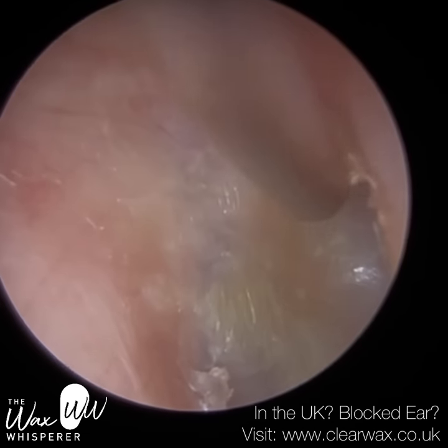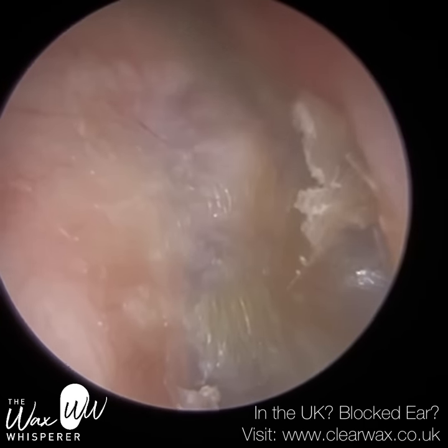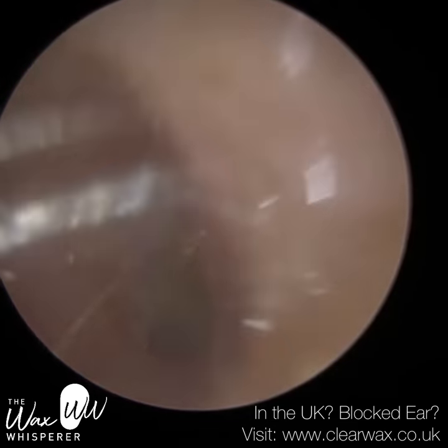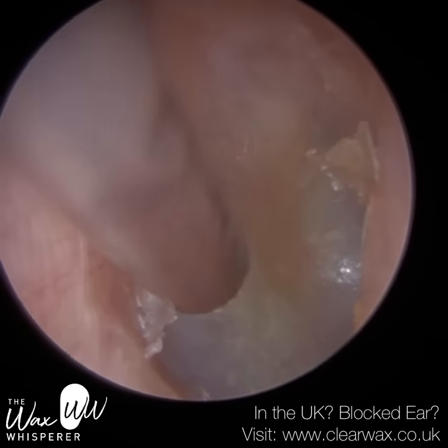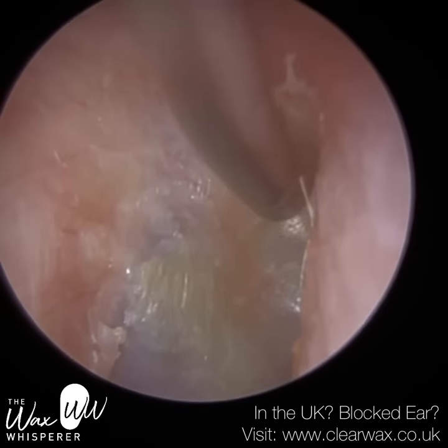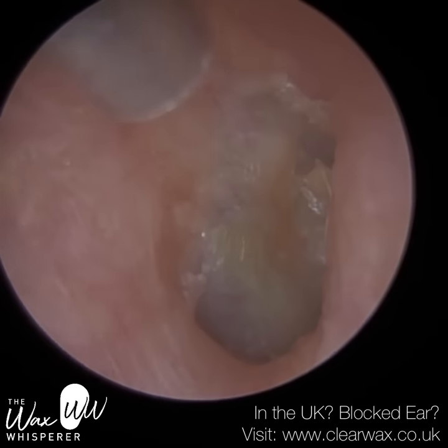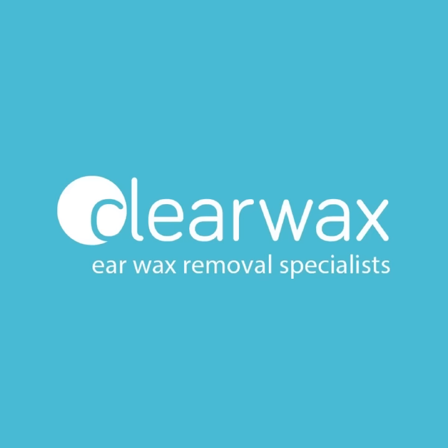Patient comfort always comes first. Ideally I would want to remove the skin, but long-term, is it really going to affect the hearing dramatically? No — the reason for removal is more preventative, because I don't think the skin's going to peel away and migrate by itself. It's very likely this patient's going to have to have regular cleaning of the ears in any case, because this is a skin condition that I think is going to be a persistent one for the patient. There's a really quite deep recess there and I tried once more — going to the back part of the ear, trying to peel the skin across from left to right, then going back to the anterior recess. Although I'm not making physical contact with the canal wall, the patient just found it uncomfortable — very likely that as the skin is coming away from the canal wall, the patient is feeling that. Both ears are clear nonetheless, and I've referred the patient to an ENT specialist regardless, for the left ear.